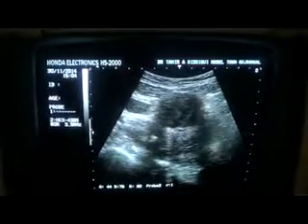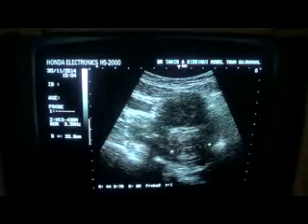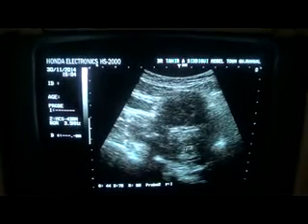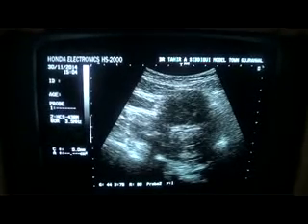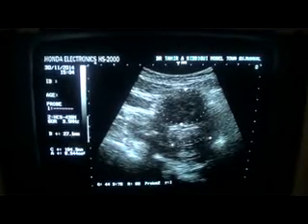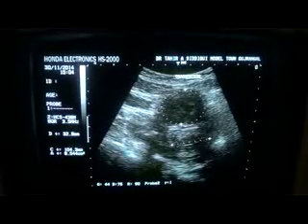This is the uterus. This is the uterus from here to here, and it measures 3.3, normal dimensions. Now this is the endometrial canal. It's in the proliferative phase. This is the fundal region fibroid. This is the uterus, and there is no fluid seen in this transverse section.